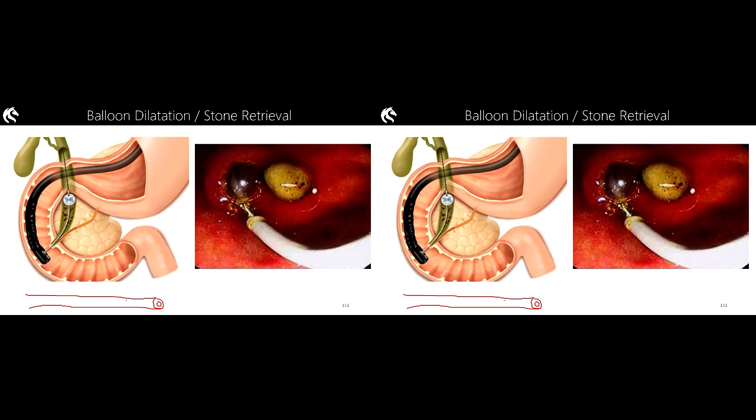We're going to have our standard catheter, that same hollow tube. But instead, over the top, we are going to have an uninflated balloon, which is going to have a little lead attached to allow us to blow it up.